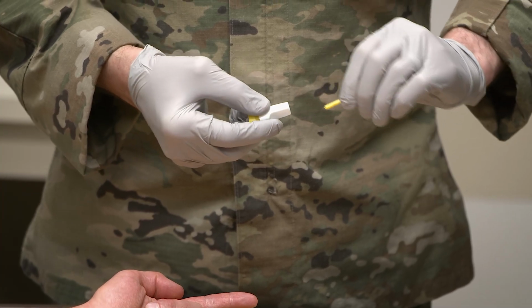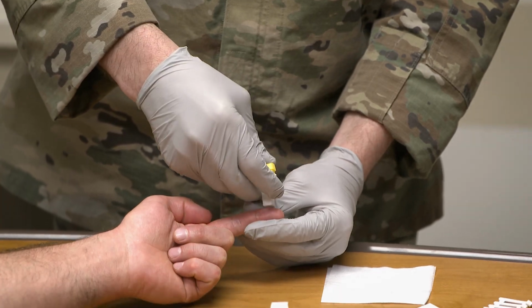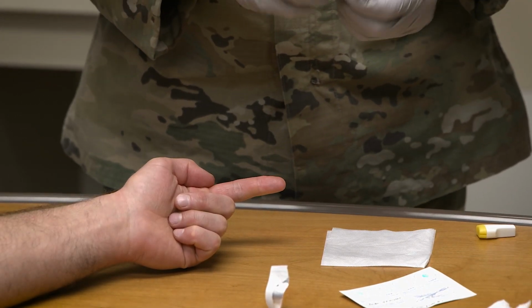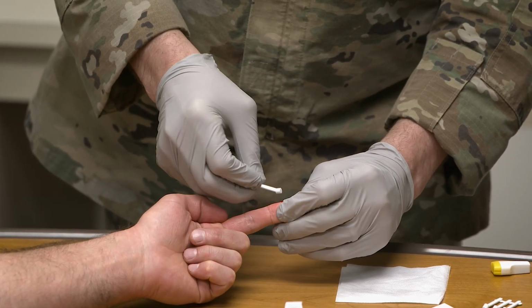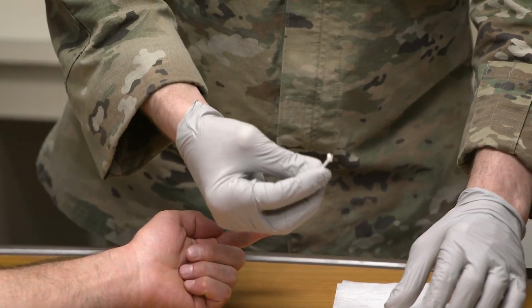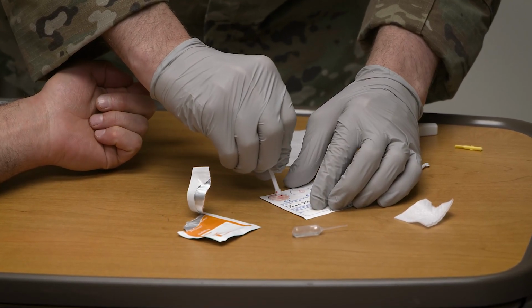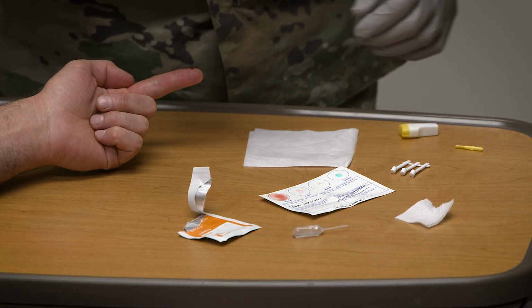Okay, next you're going to take off the protective cover there. Go ahead and press this up against the patient's skin. And once you see a drop of blood, you'll take each of the Eldon sticks, just enough to cover the top of the Eldon stick, and you're going to apply it in the center and just slowly in an outward direction, kind of circle covering to the edges.